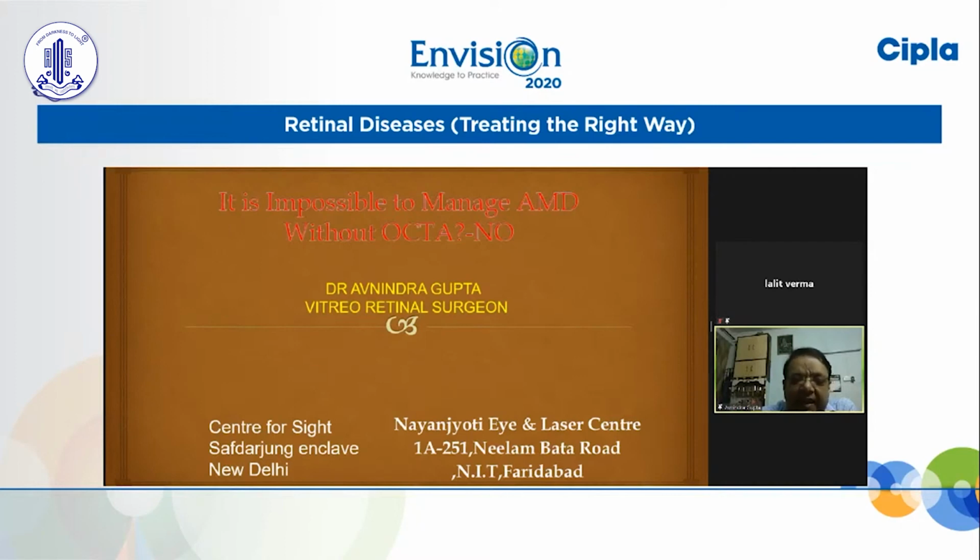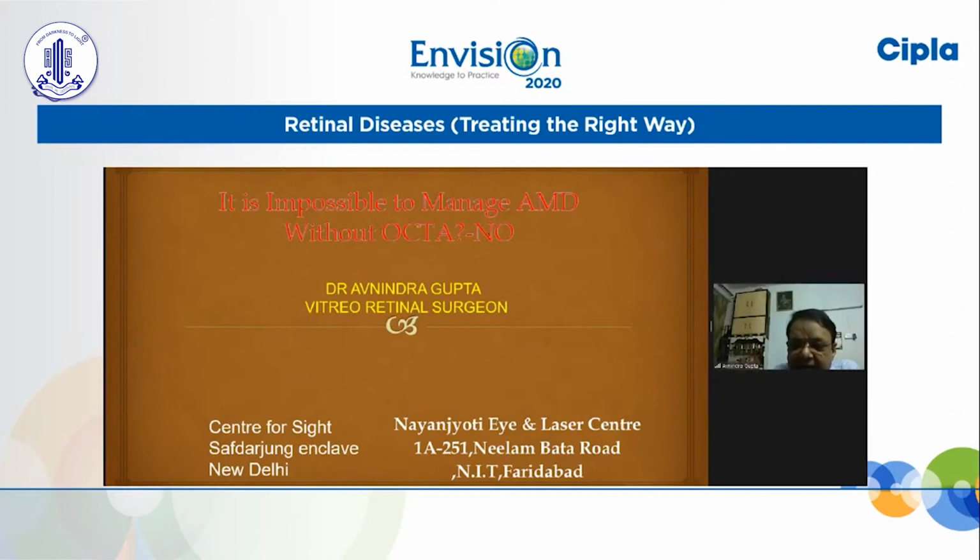First question I would like to ask Prashant Bhavankule is, do you differentiate between OCT and OCTA, or are both the same? OCT is an integral part of OCTA, sir. So you say OCT and OCTA are different or the same? I want to know, can you get away with the OCT? Do you see the morphological picture, or only OCTA pictures? Sir, OCT is an inbuilt system. OCT comes as a primary platform and then comes the OCTA. So once you have an OCTA, everyone has an OCT.